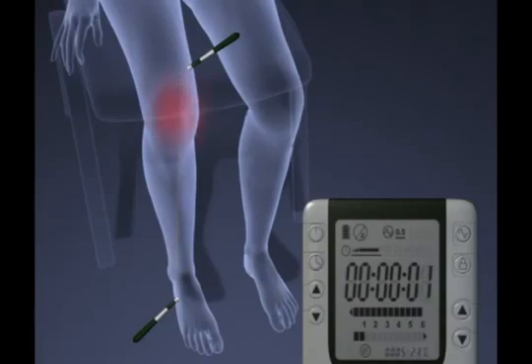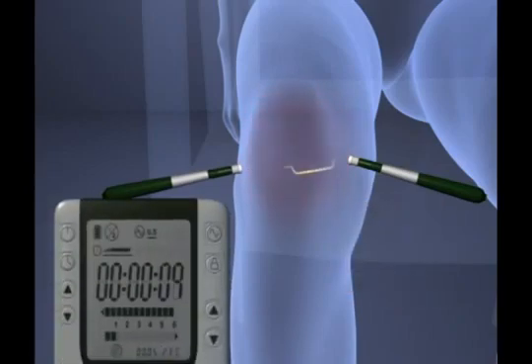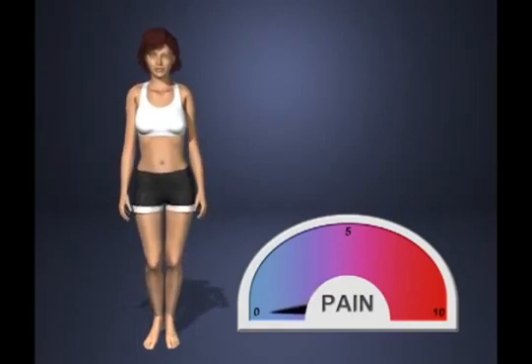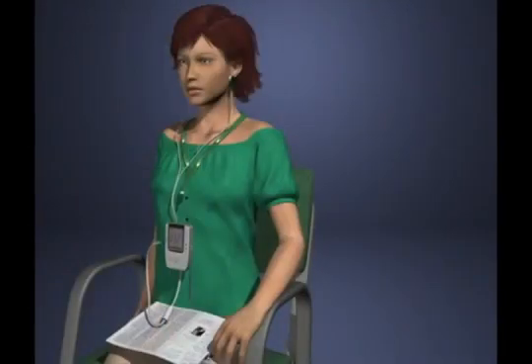Always place the smart probes on both sides of the area being treated to direct the current through the problem area. Continue treatment until pain is completely gone or substantial relief is achieved. There is usually an increased range of motion in treated areas. Sometimes treated areas of the body feel stiff or tight when the pain is gone. This will wear off over time. Finish your treatment with cranial electrotherapy stimulation.